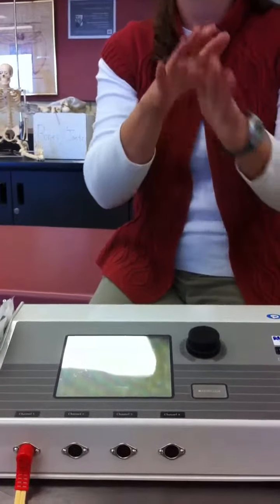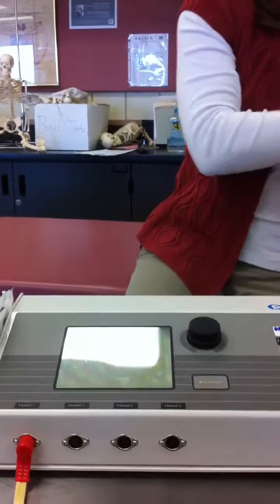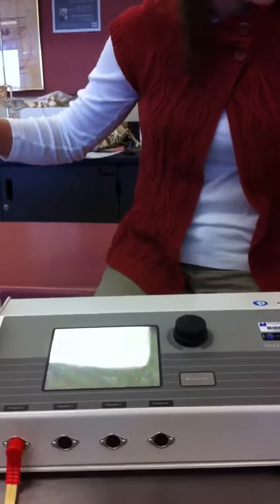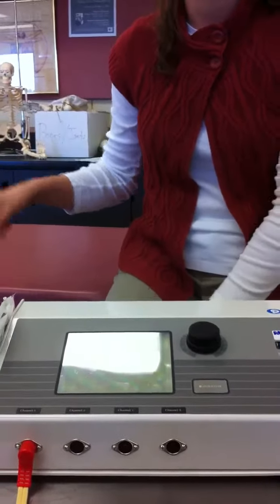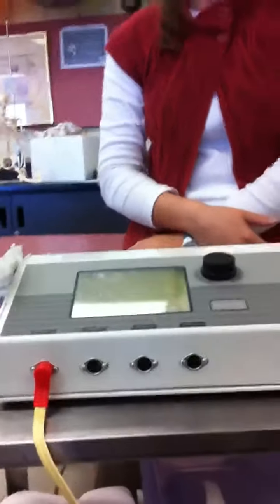But again, we don't care about the number on the machine. We care about what's happening with your patient. So as your finger is spinning, your eyes should be on the target tissue of that which you're contracting. Okay? Once you see the twitch or the contraction, you're going to depress this knob. Okay?